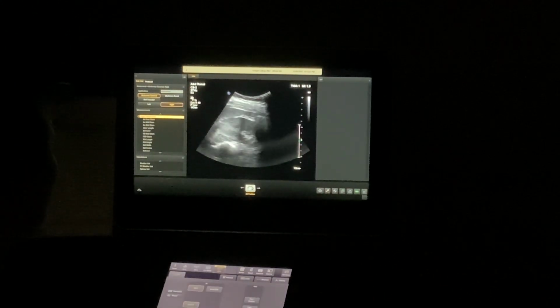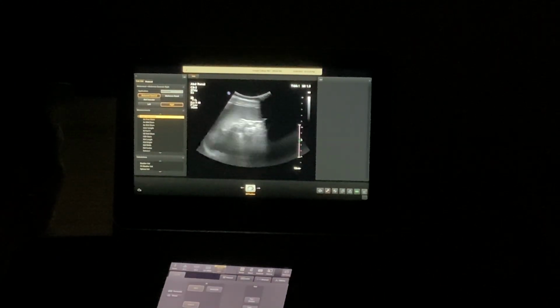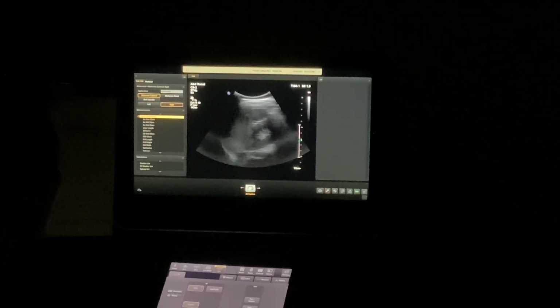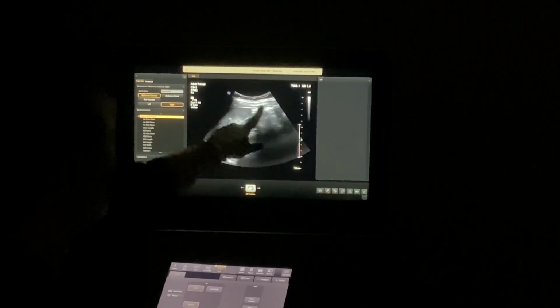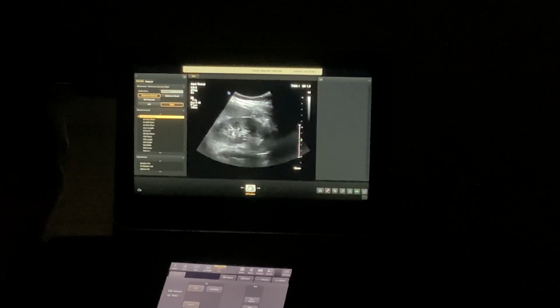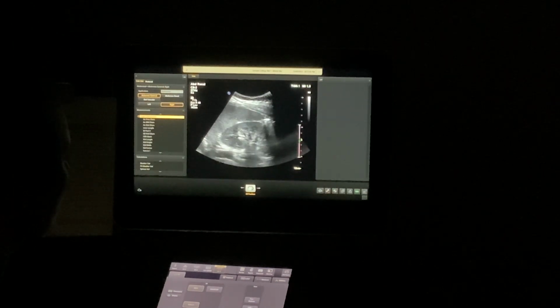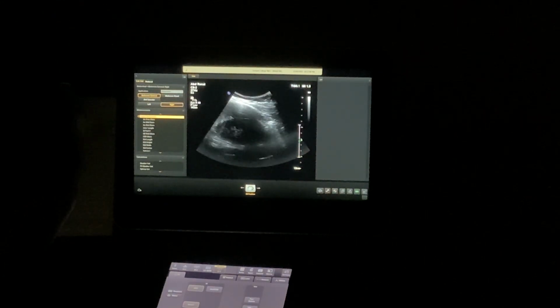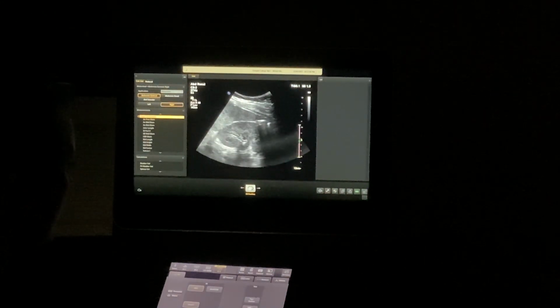If you have a shadow from a rib in the way, represent that. That's just contact loss. See that gas here covering everything? If I find no way to get around that, no window, take it in pieces. That will be your multiple images. Small breath and hold it. Breathe. And then when you're ready, a deep breath.